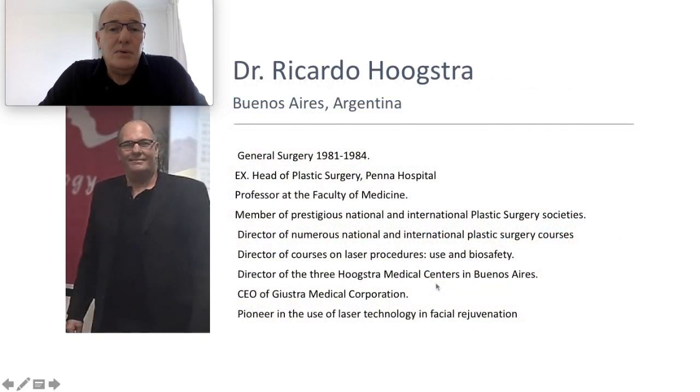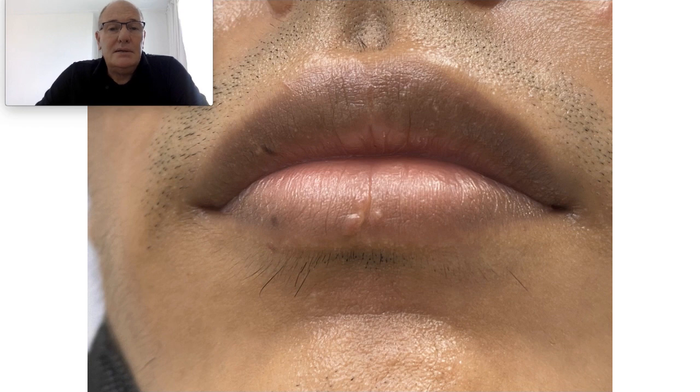This is my curriculum, and I can improve this superelevated or raised scar with laser. I have an erbium laser, Lotus laser, that I shoot the scar and I flatten it. I do not put anesthetic cream. I do not make local anesthesia.